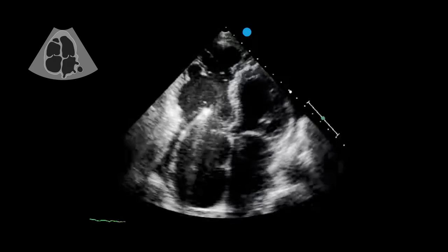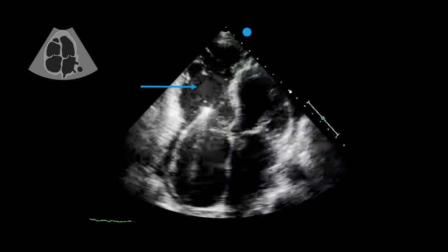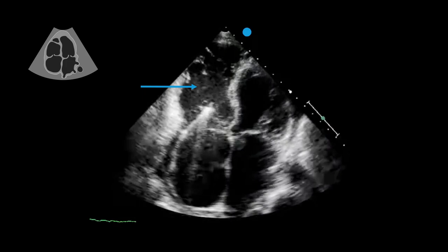In comparison to that healthy pumping ventricle we just saw, this is an extreme case of ventricular dysfunction. If we focus on the right ventricle in the apical four-chamber view, it looks and moves very differently from the previous one. Let's take a look at this ventricle in a little more detail using a step-by-step approach.